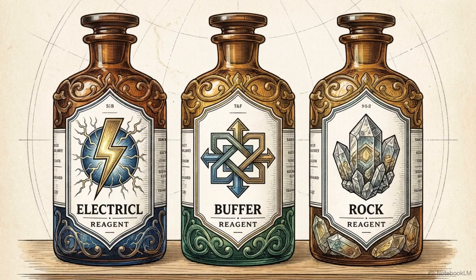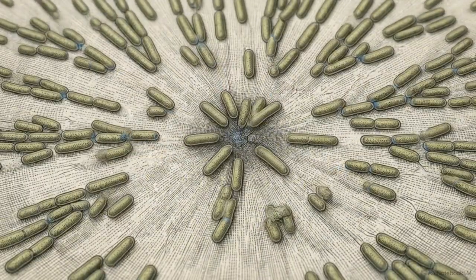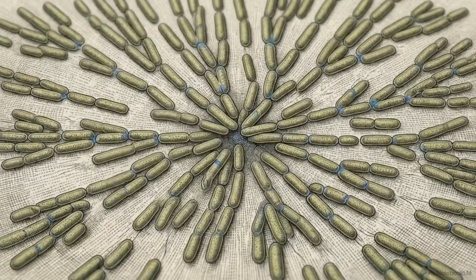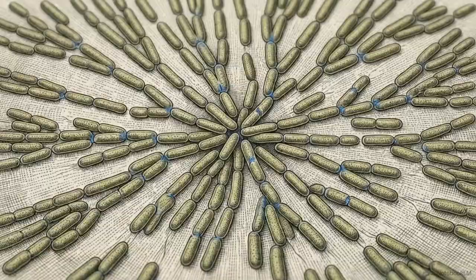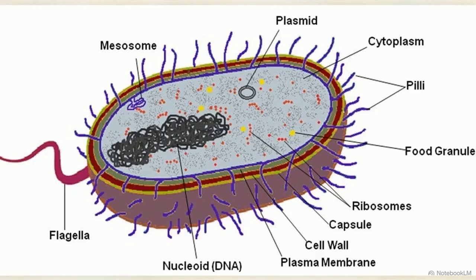In a laboratory setting, these elements are translated into practical media constituents: energy sources, buffer salts, and mineral metals. Satisfying a cell's foundational elemental needs is the mandatory first step before attempting to force that cell to overproduce specific biological products. The simplest and most robust expression system used in biotechnology is the prokaryotic cell, specifically strains of E. coli. To manipulate these bacteria, researchers target specific internal structures: the plasmid for DNA and the ribosomes for protein synthesis.